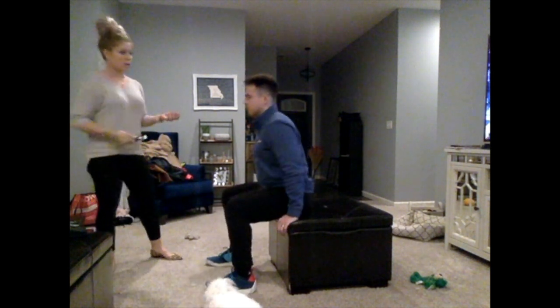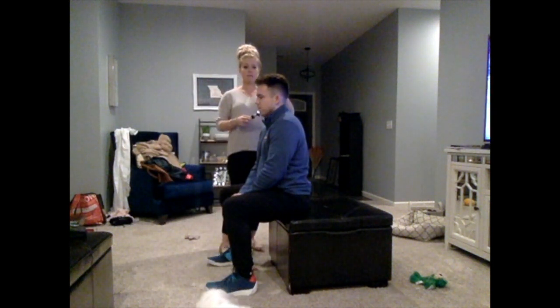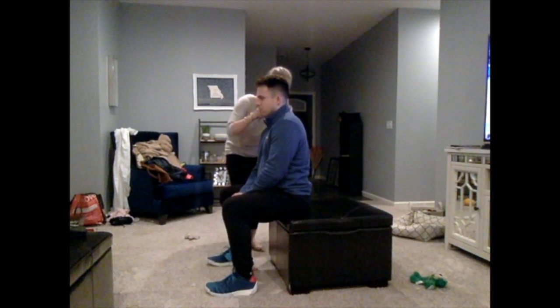But since he didn't experience any, I'm going to go ahead and get my otoscope, turn on the light. I'm going to pull the pinna up and back for an adult, and then for a child, I would pull back and down. And this just opens up the ear canal so I can see further into the ear. So when I'm looking in the ear, I'm looking at the coloring, looking for any lumps or lesions.